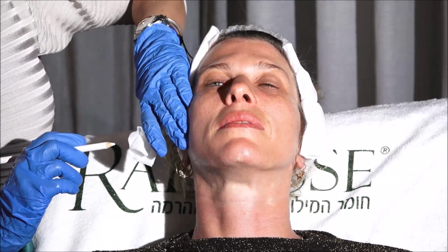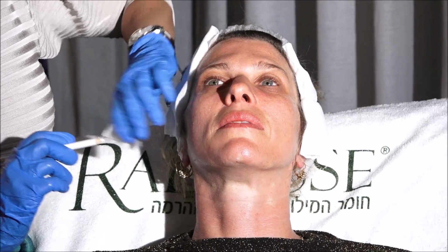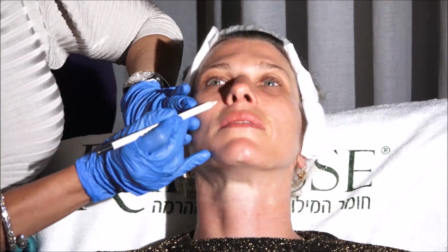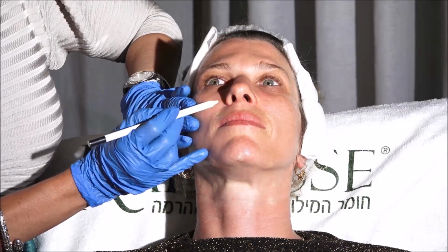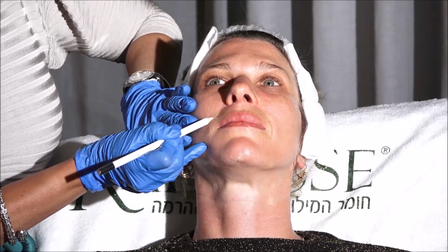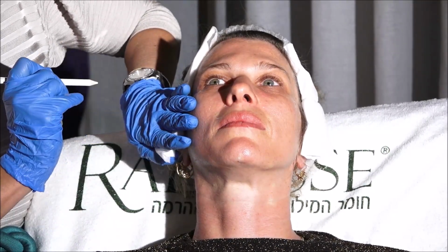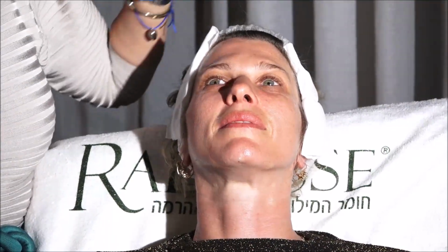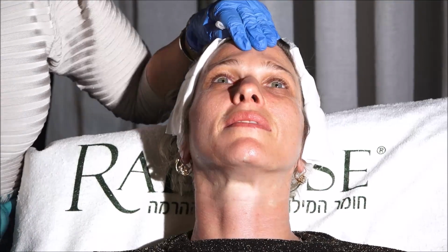And we're going to tighten the lateral face with Radiesse dilute. So I'm going to use Radiesse dilute, Radiesse Plus, and for the perioral approach, we're going to use Belotero Volume and Balance in the wrinkle. So you're going to see all the techniques: deep, superficial, layered approach, and then the toxin last.